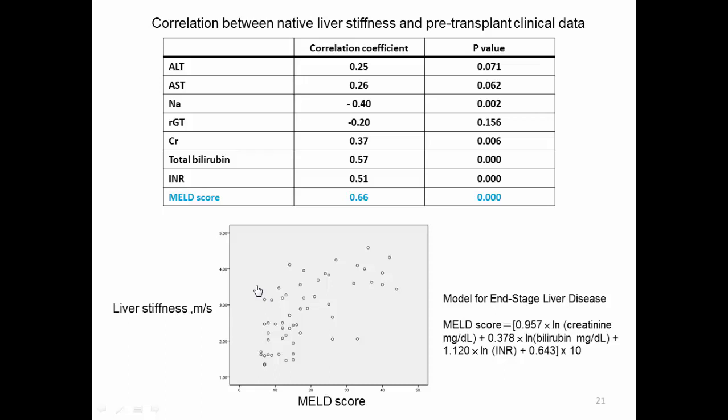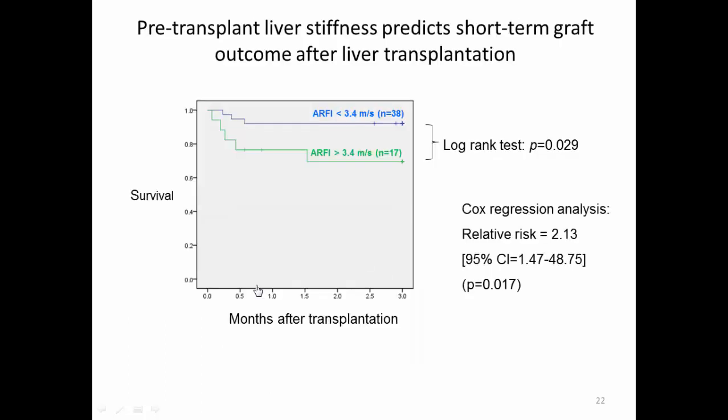And this shows that there is a high correlation between the MELD score and the liver stiffness. Interestingly, the liver stiffness before transplant is actually related to the outcome of the patient in the short term after liver transplantation.